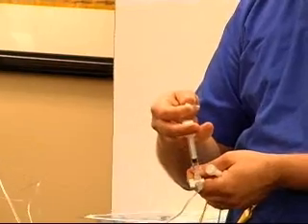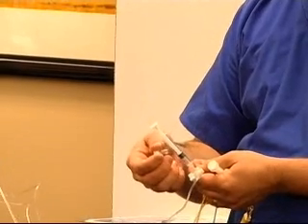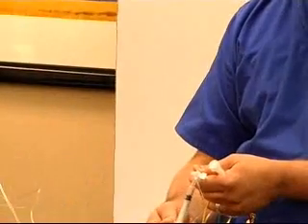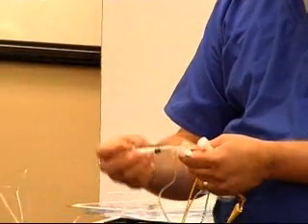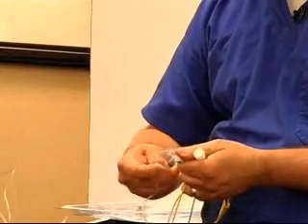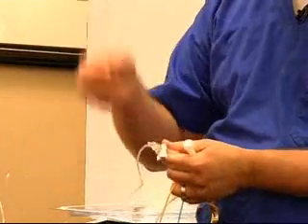So if you pull up like this, sometimes you'll get this air bubble that gets behind it, and it can skew your numbers theoretically. So if you pull down to get your PA sample, and you usually only need about a cc, okay? So we're going to turn this off. Now here's where the cap comes in.